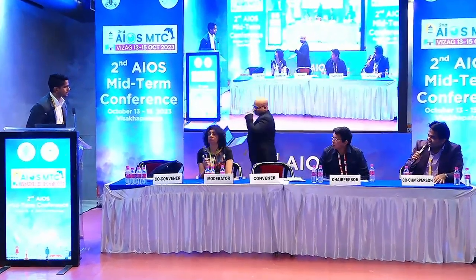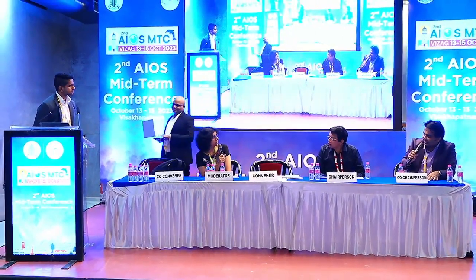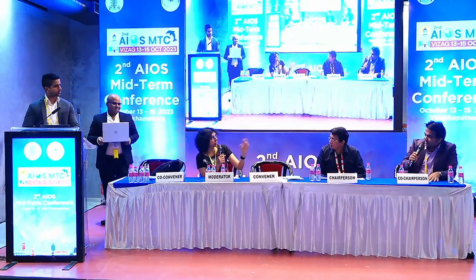Mal can comment. Yeah, so I've also seen a couple of patients with iris cysts preoperatively, because we do a UBM regularly to try and match the sulcus to sulcus diameters, and the iris cysts were what precluded the use of an ICL in those patients. So it's not a very common occurrence, but it's something we have to keep an eye on.